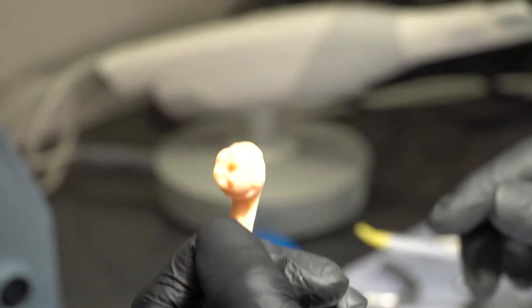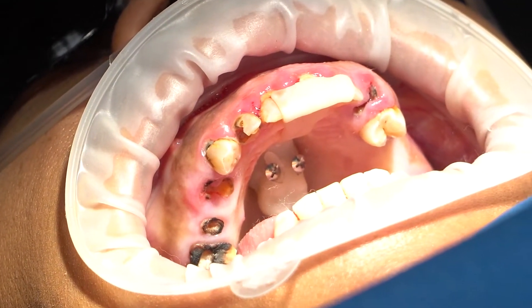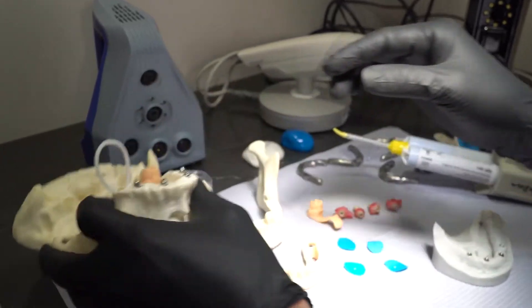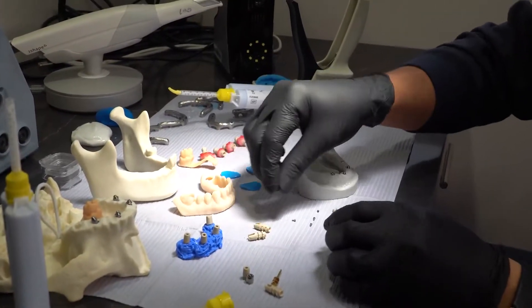Here is our technique as well — this is called the ART, artificial reference tooth, to scan our patients in case you don't want to leave a tooth. We're going to use this one and put it in position, then scan the teeth with the ART so that we can acquire proper scans.